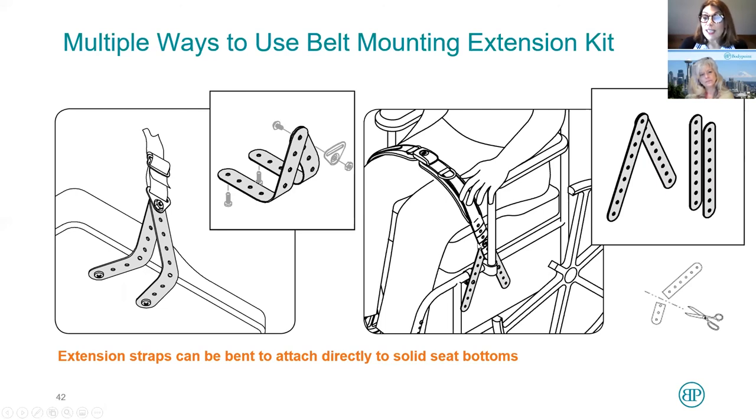That shows you how you can easily go around an obstacle to mount a belt where you want it. One other thing you can do with this belt mounting extension kit is that it's very pliable. You can bend it at 90 degrees and place the bolt underneath. If you've got a solid seat pan, you can drill into the bottom and it's another way to attach a belt. I remember two different chairs where I had no other option and this is what I used — it worked very, very well.